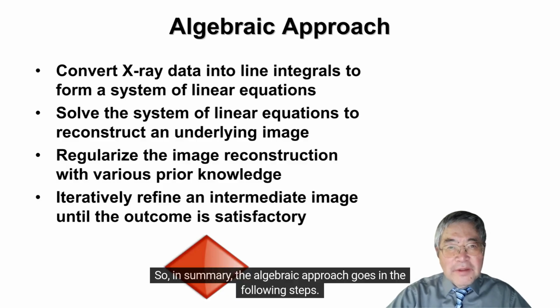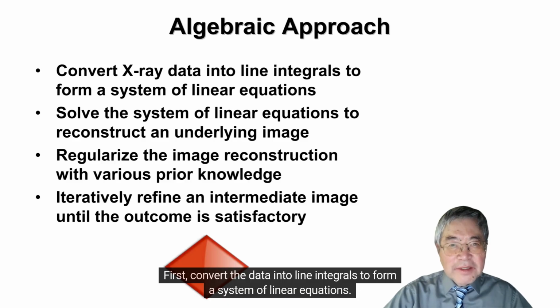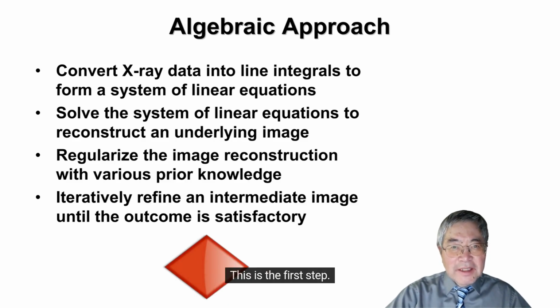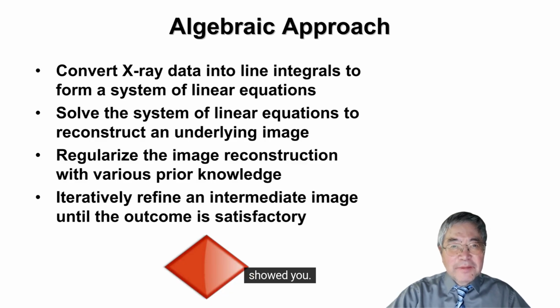So in summary, the algebraic approach goes in the following steps. First, convert the data into line integrals to form a system of linear equations. This is the first step. Second, solve the system of linear equations to reconstruct the underlying image, like the iterative process I showed you.